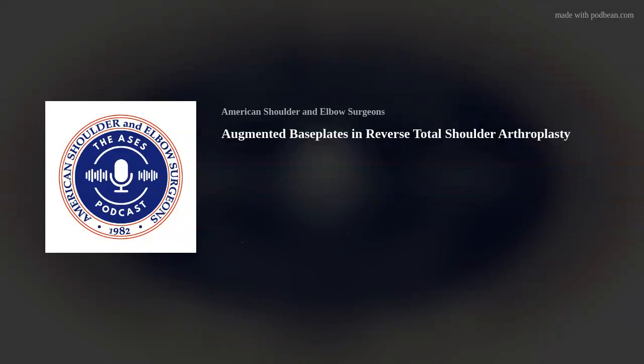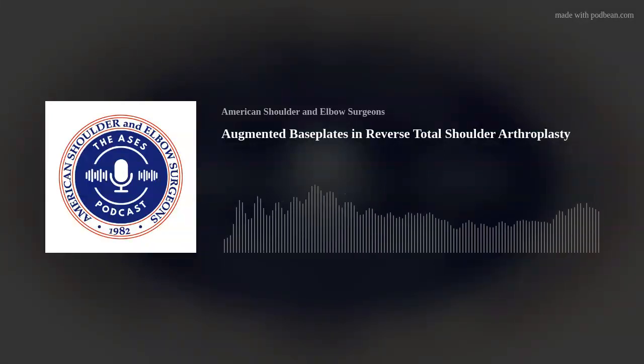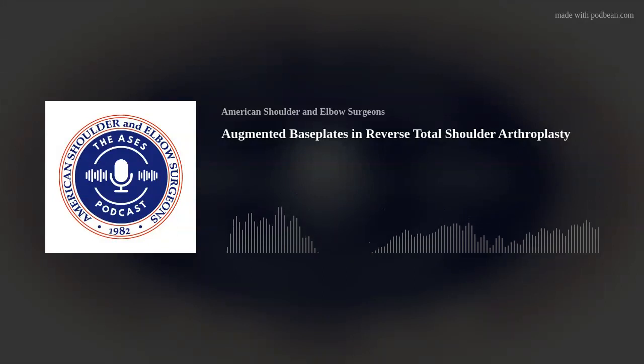Yeah, so I would typically have preoperative planning. And sometimes it's interesting that these patients who have a normal glenoid actually are superiorly tilted a little bit, especially in rotator cuff arthropathy or massive cuff tear without significant erosion, which is interesting. But say they're 10 degrees superiorly tilted on preoperative planning and maybe 5 degrees retroverted.